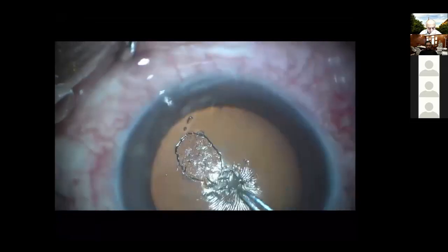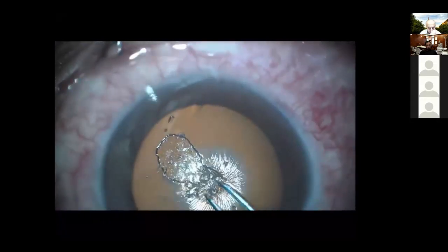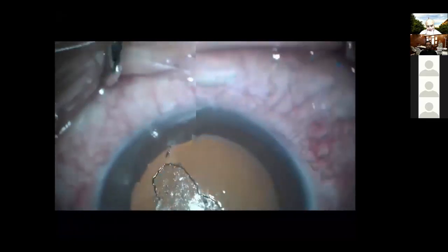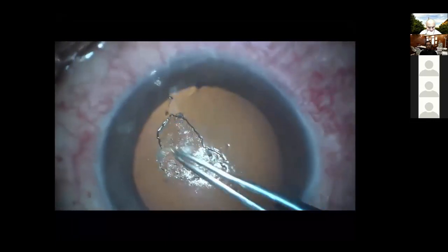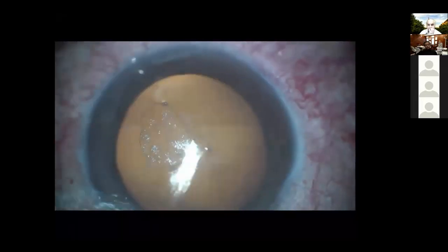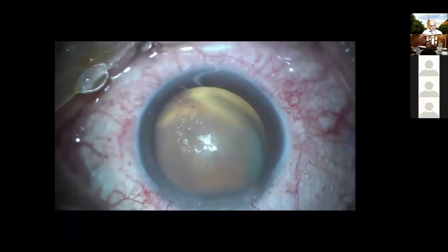And you will notice that after I complete removing my nodules that are inducing an opacification in the cornea, the rest of the cornea is quite clear and will allow quite a satisfactory vision after I completely remove them and then proceed with my cataract. Nearly almost all of the opacity now has been removed. It's quite simple, actually, and it doesn't take much work from the surgeon to remove most of the opacities. Now I'm putting saline on the cornea and viscoelastic to improve visibility while removing the cataract.